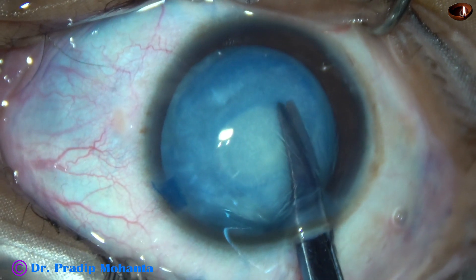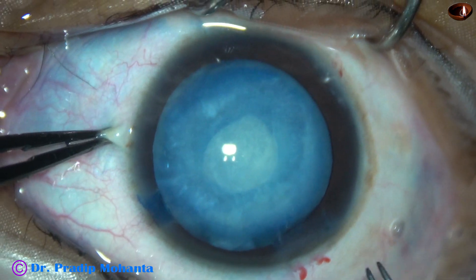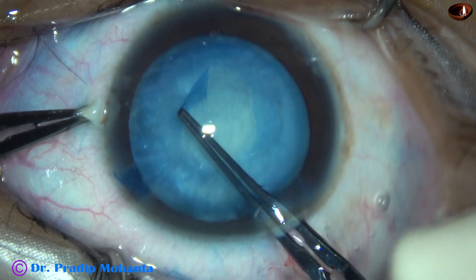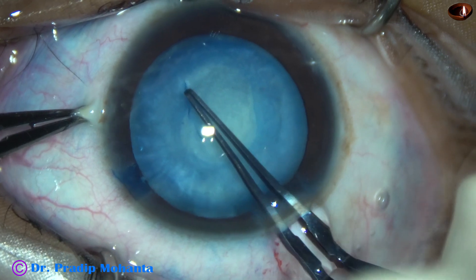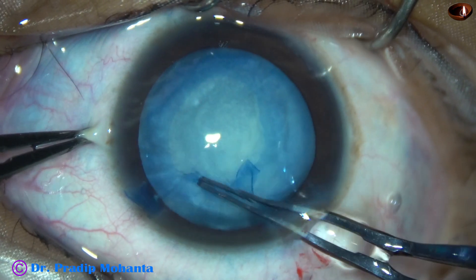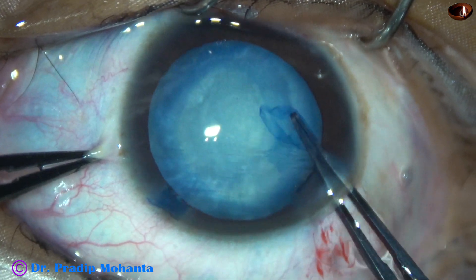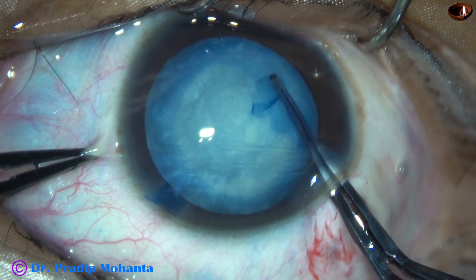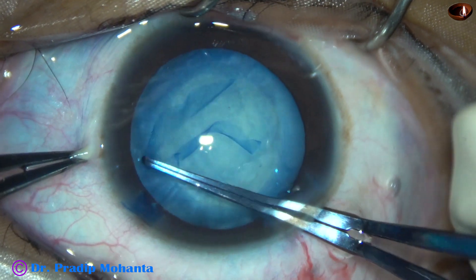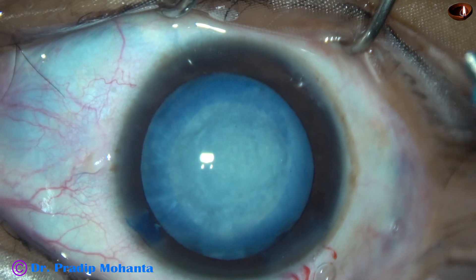A small nick is made at 7 o'clock. This capsular tag is held with the forceps again, and then the rhexis is enlarged. If we remove a lot of cortex at this time, there is no tendency for the capsule to run to the periphery.